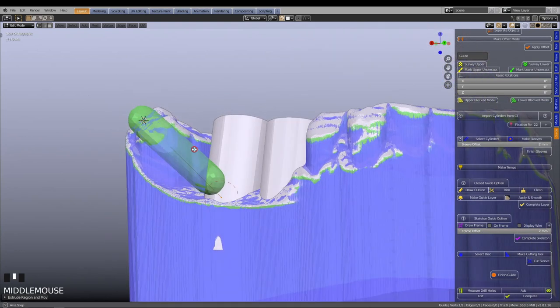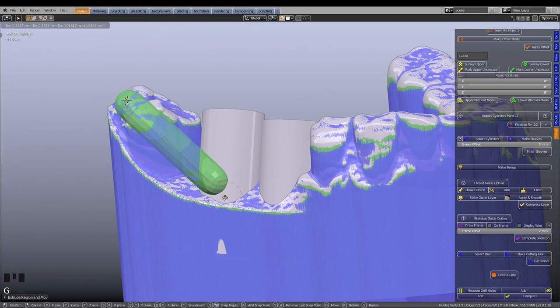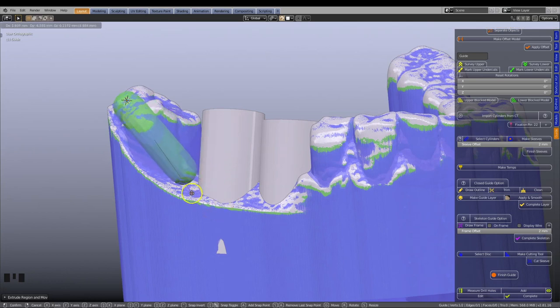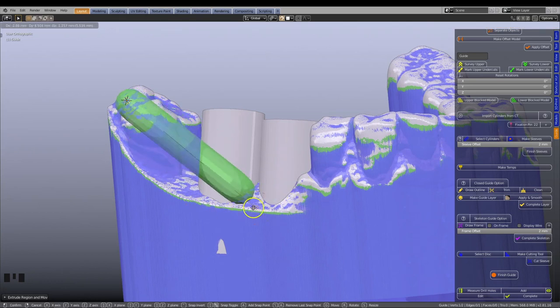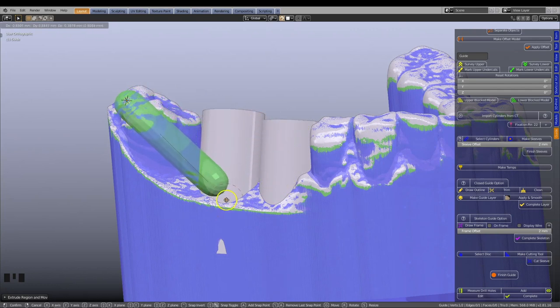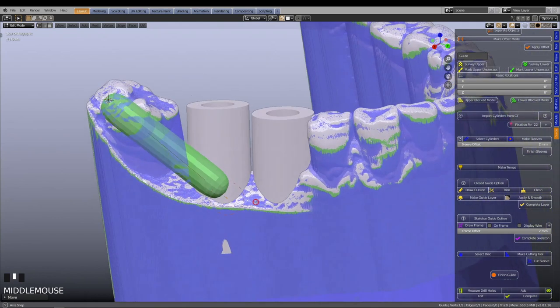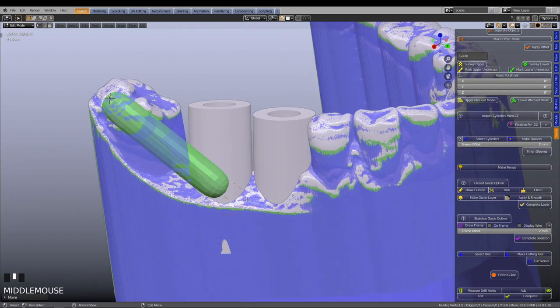You can now select a vertex, and by using the G key, you can freely move the line. Since the magnet tool invokes the line to adhere to the blocked out model, it is best to place the line close to the surface of the model.